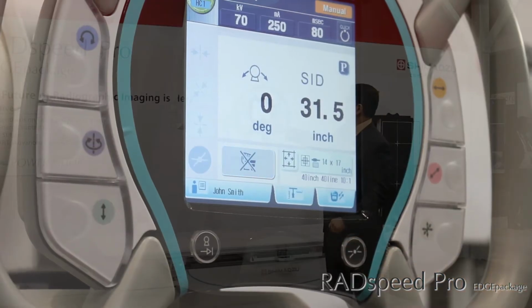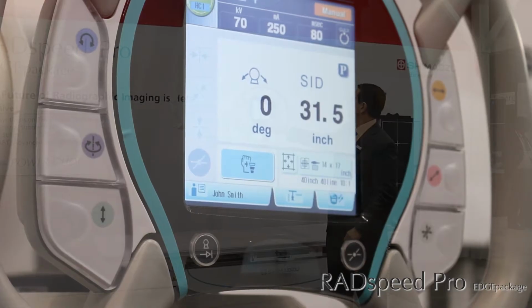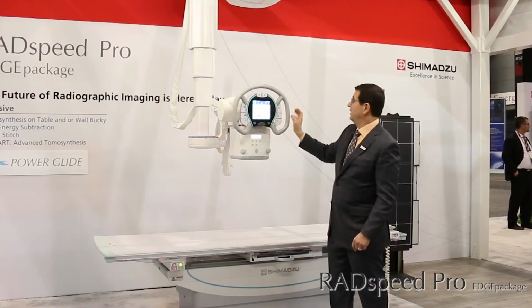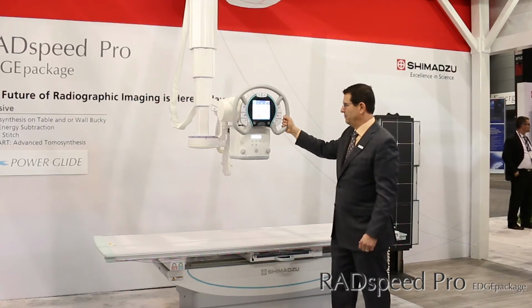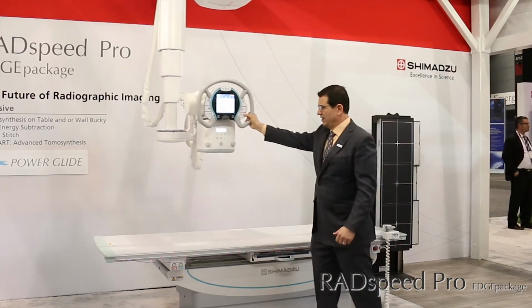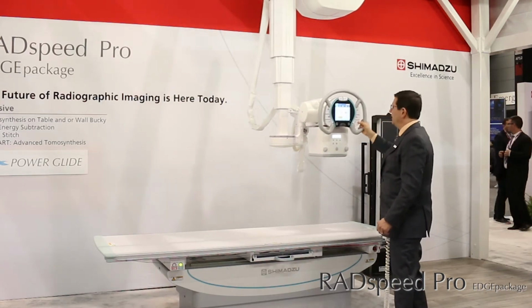The settings can be set right here. You have a +1, a +2, a +3, which is in the red. The +3 is the fastest. So if you're ever set in +3, it's really meant to be able to, if you take it, to go fast from one area to another quickly and then stop, okay?